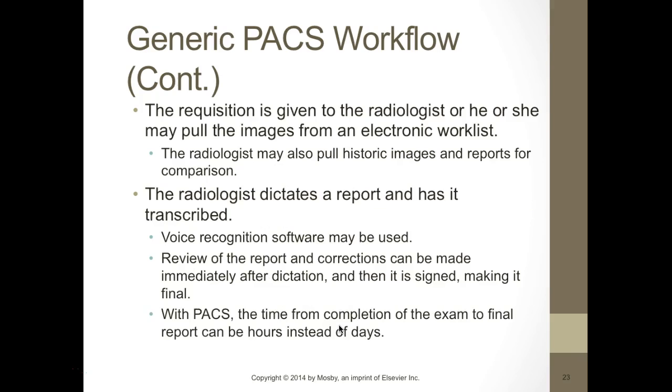The requisition is given to the radiologist, where he or she may pull the images from the work list. The radiologist may pull historical information on the patient also to compare. So the radiologist dictates the report. A lot of times, like I said, they have voice recognition software where it's instantaneous. They review the report, make corrections immediately, and sign it, and it's a final report. So this turnaround can be minutes, which is great.